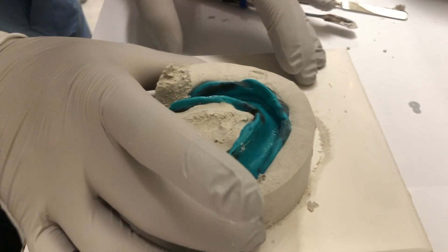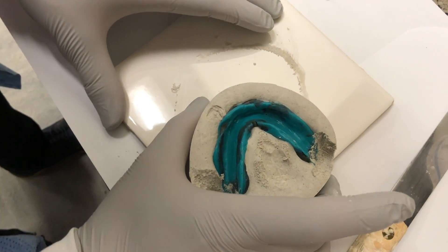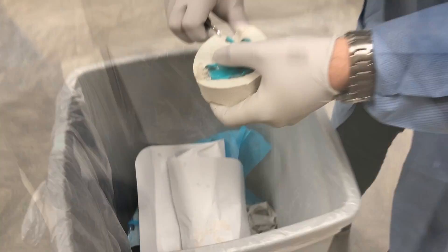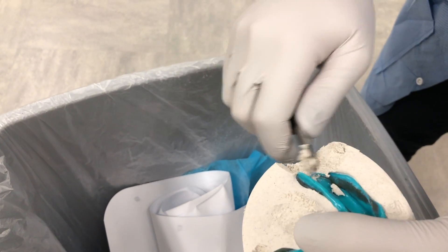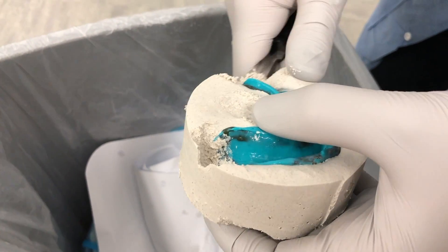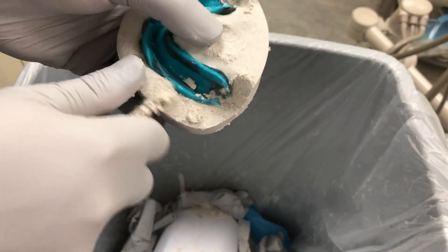Remove the boxing wax and separate the plaster and pumice boxing from the base underneath it. Using a lab knife, trim the excess plaster and pumice from around the impression. Remember that you need to keep about 3 to 4 mm of your impression borders above the plaster and pumice.